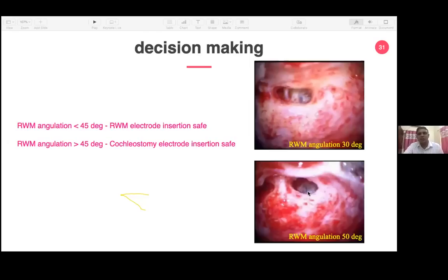You can still do a round window membrane insertion, taking out this lateral most portion of the external auditory canal, the inferior most region of the posterior tympanotomy side. You can sacrifice the chorda tympani. You can go with an anteriorly extended posterior tympanotomy.